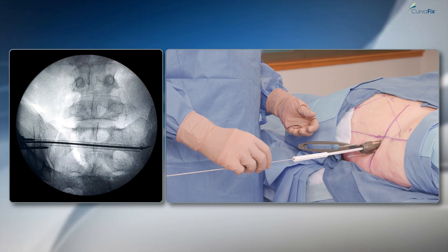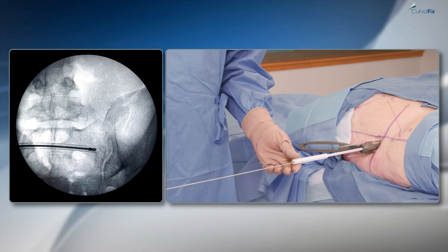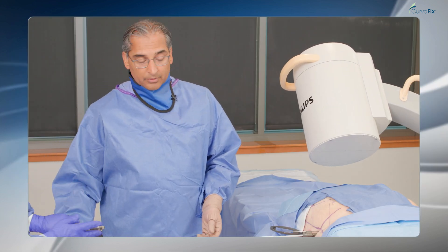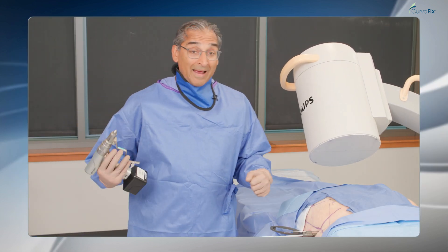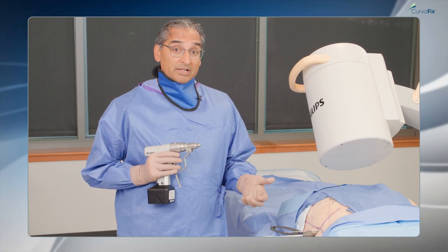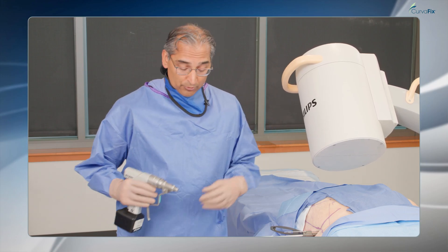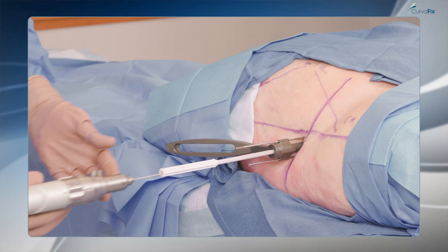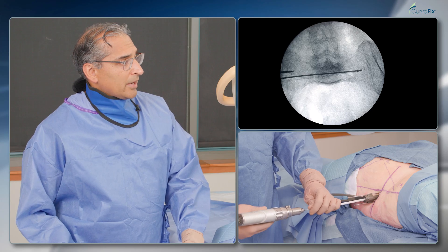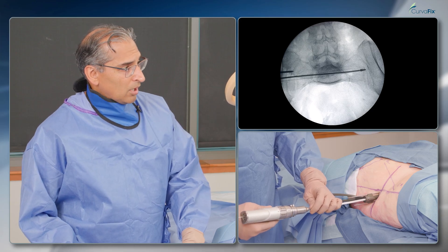Drill tip wire is in — you can see the drill tip there. Because in good quality bone, if you try and mallet the ball tip guide wire through, there's a likelihood you'll bend it because it is flexible, and in some hard bone it may not be strong enough to violate or get through that cortex. You can see now I am going through the SI joint and through that medial wall of the iliac wing.